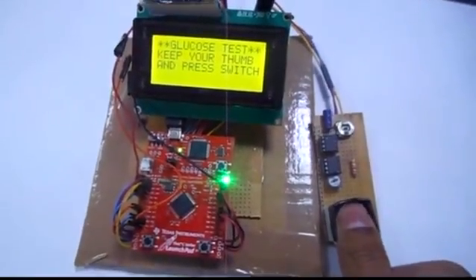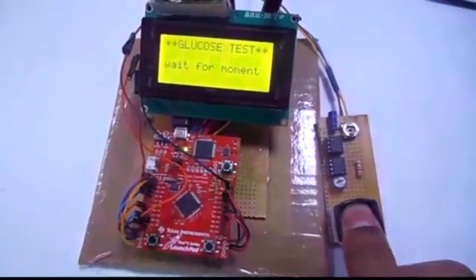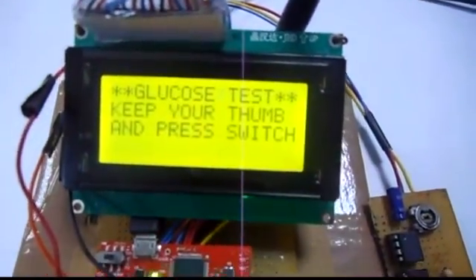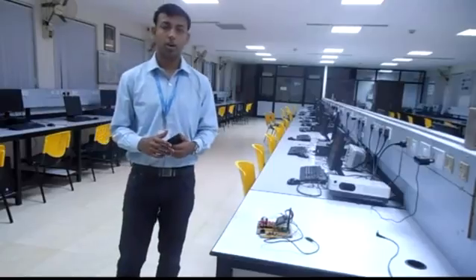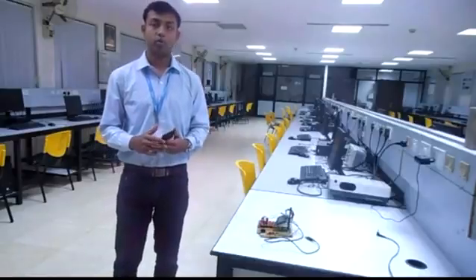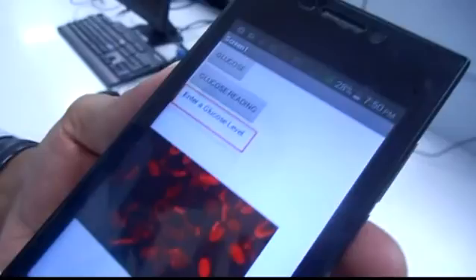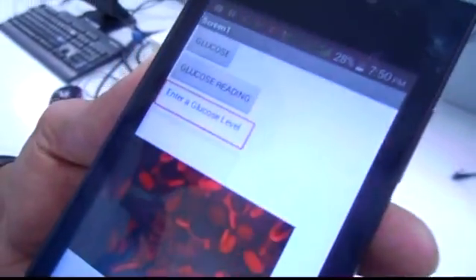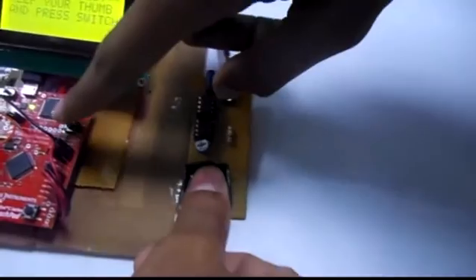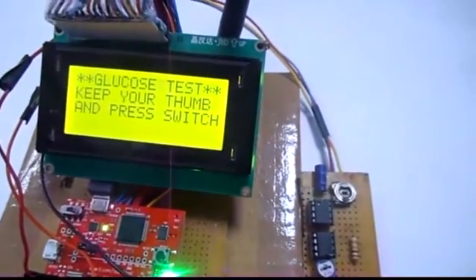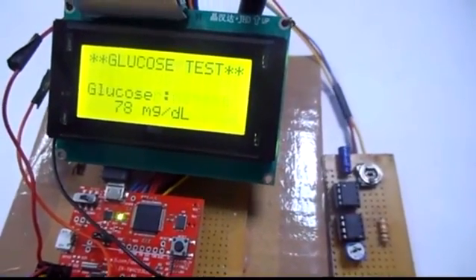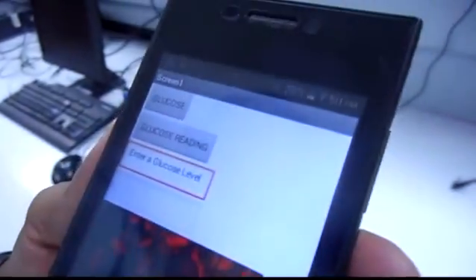It is important to know your glucose reading. To get your glucose reading, keep your thumb properly over the sensor and press the switch on the launchpad — it will show your glucose level. Since everyone is using an Android phone, we made our device more user-friendly by sending the glucose reading to an Android application. As soon as the reading is checked on the device, the same reading appears on the Android application — for example: your glucose reading is 78 and your glucose level is normal.